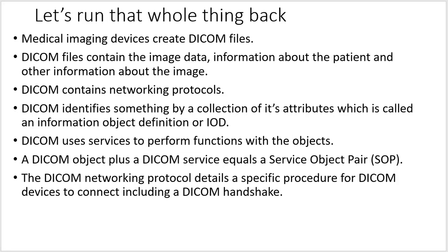So let's run that whole thing back. Medical imaging devices create DICOM files. DICOM files contain the image data, information about the patient, and other information about the image. It's not just the picture. It's what makes up the picture plus the data around that that explains what the patient is, what machine did it, all sorts of things like that. DICOM also contains networking protocols. It's not just a file format. It also is a network protocol.